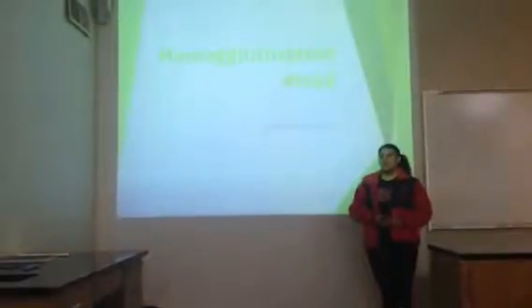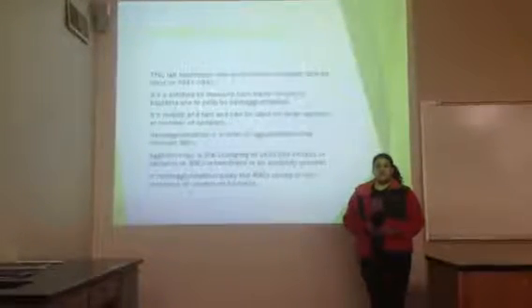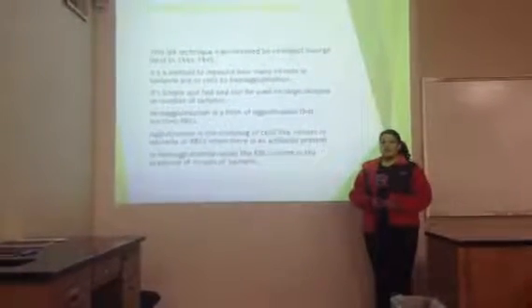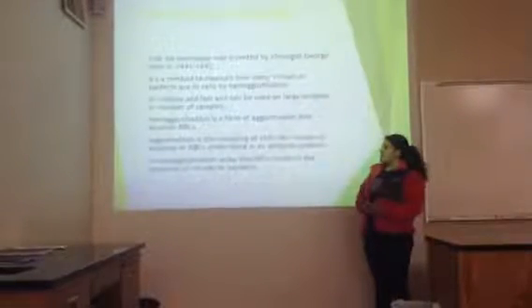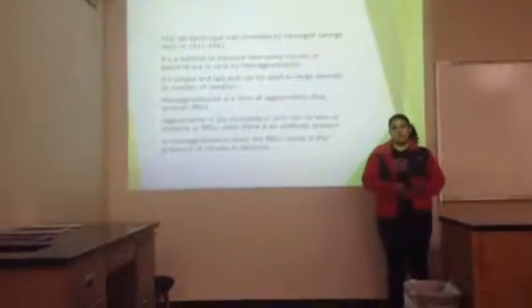So the lab technique I chose to do is hemagglutination assay. This is a technique that was invented by George Hirst in 1941-1942. He was an American virologist. It's a method to detect viruses or bacteria using red blood cells. It's simple, fast, easy, and it can be used on large samples, so it makes it an ideal lab technique.